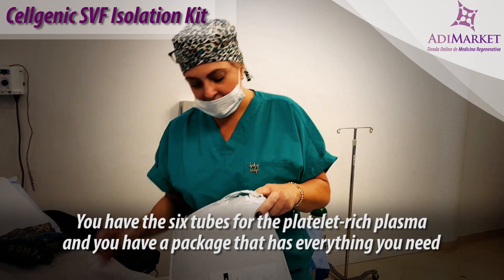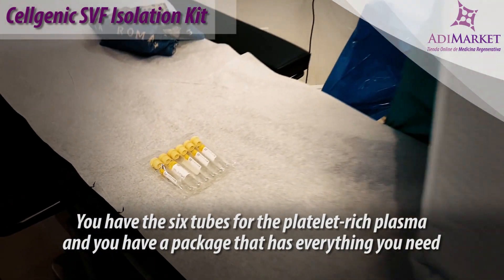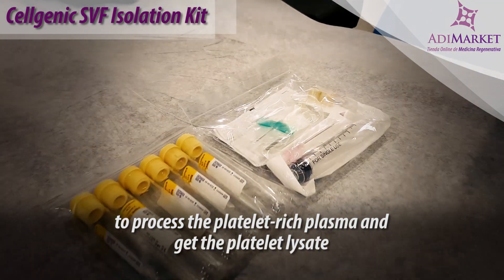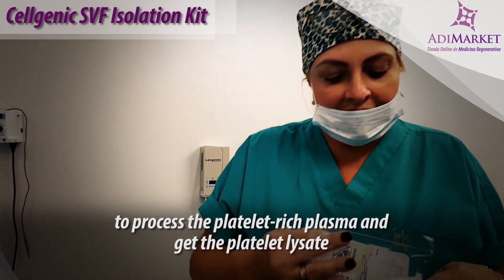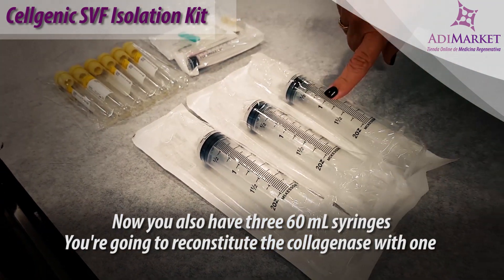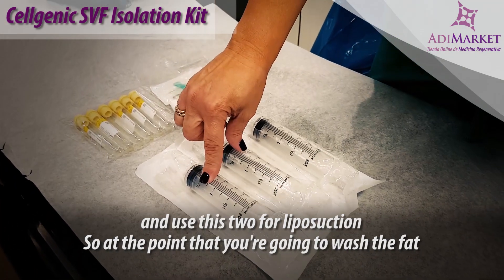You have the six tubes for the platelet-rich plasma and a package that has everything you need to process the platelet-rich plasma and get the platelet lysate. You also have three 60 ml syringes — you're going to reconstitute the collagenase with one and use the other two for liposuction.